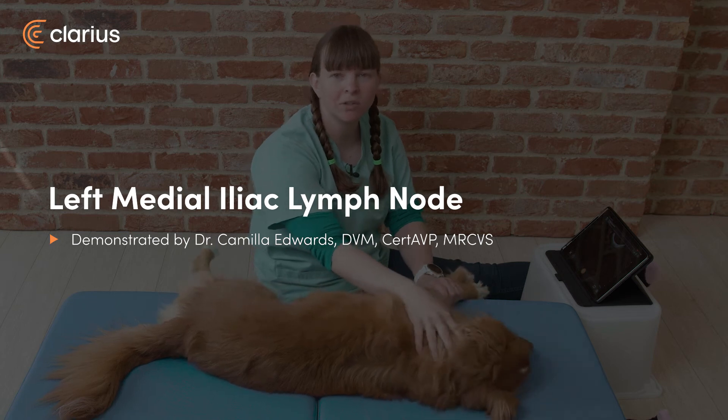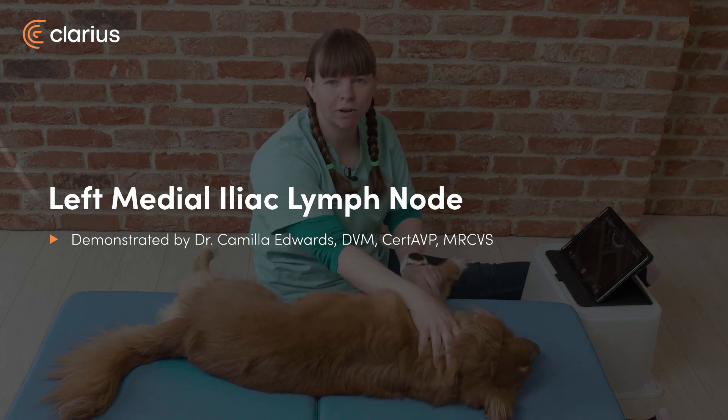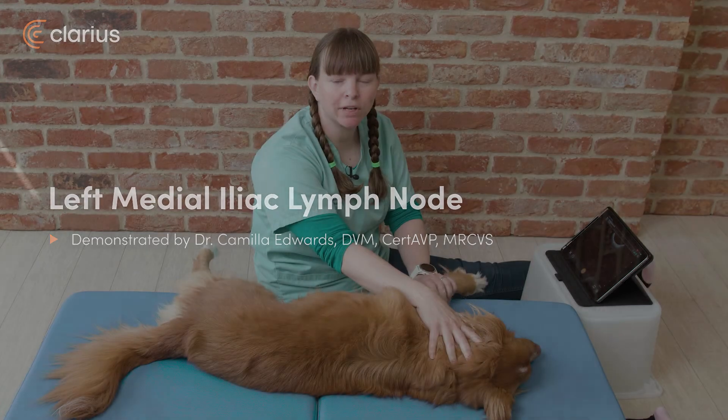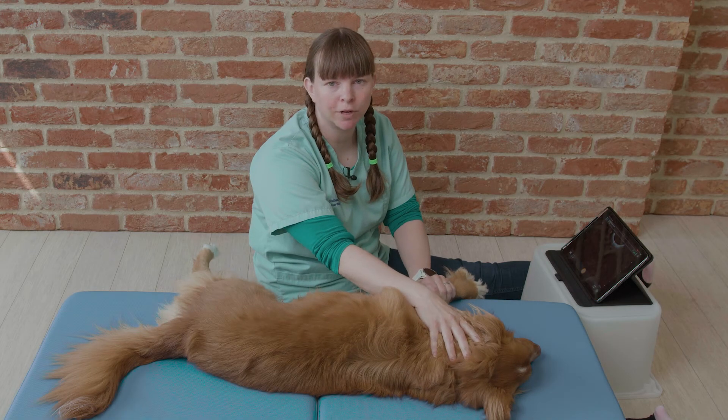Hi, I'm Dr. Camilla Edwards from First Opinion Veterinary Ultrasound. Today we'll be looking at how to find the left medial iliac lymph node.